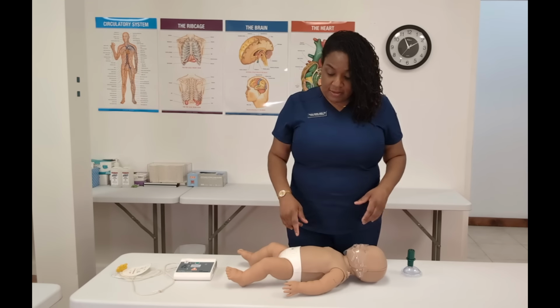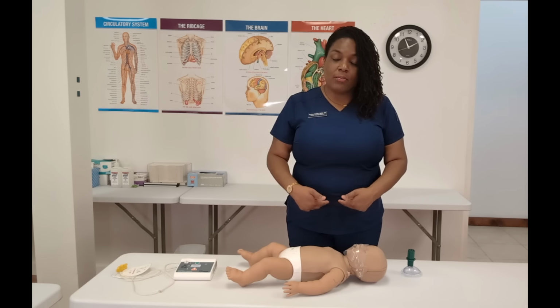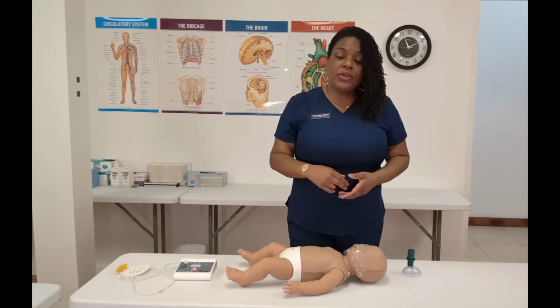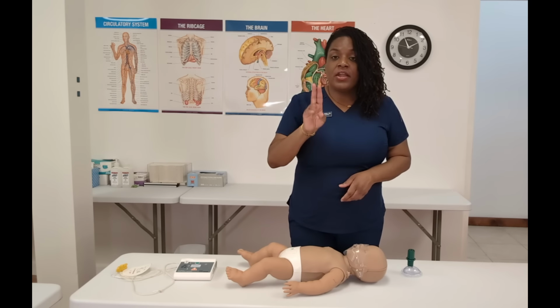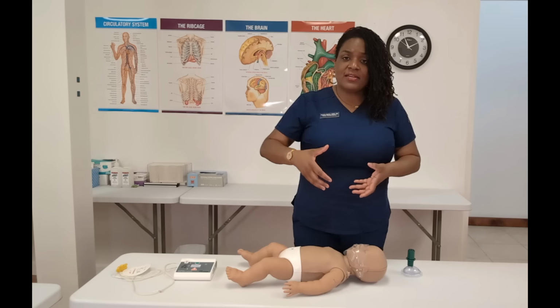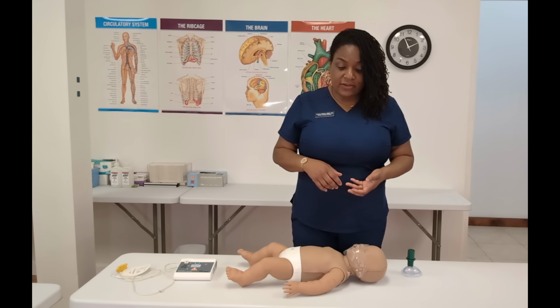If you have the Preston mannequins, they have a feedback device and you just want to activate it by turning the little blue button on, you're going to press it, that's on their diaper area. You can do infant compression one of 2 ways. You can use your 2 fingers, or if you find that hard because maybe you have arthritis, you can do the 2 thumb encircling hand technique. And I'll show you both techniques right now.